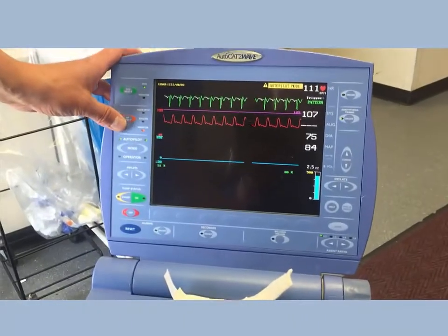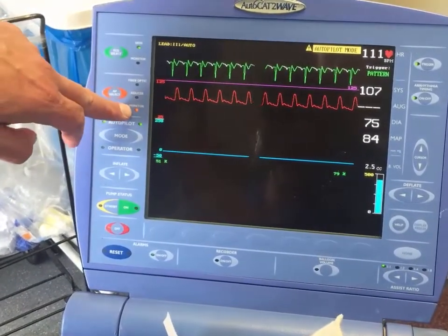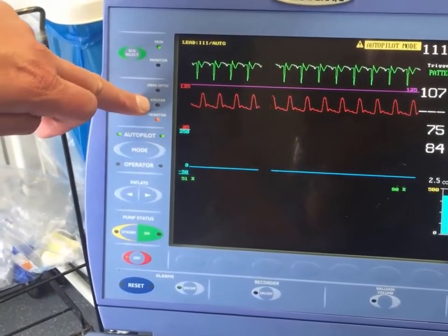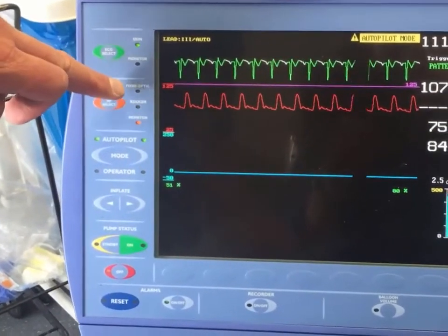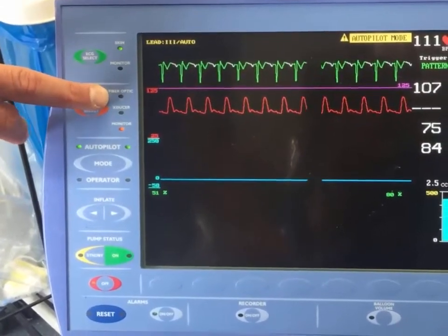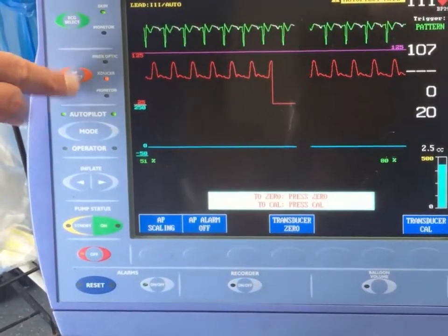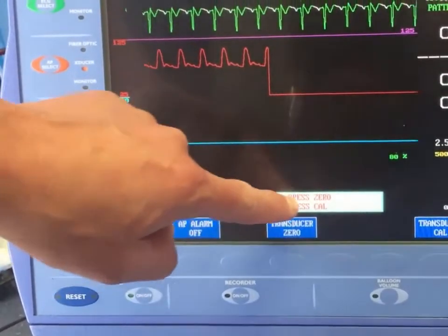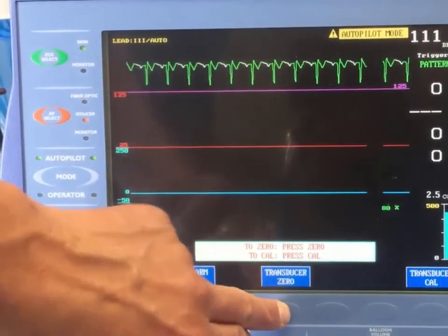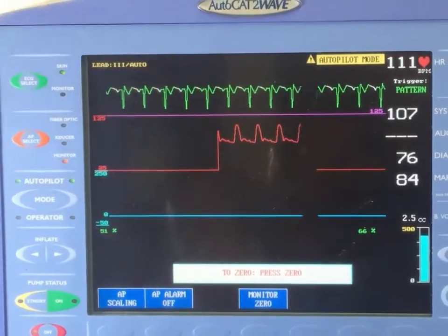We are going to zero the arterial line. There are three arterial pressure select indicators: the monitor, which can be slaved to the bedside monitor but is rarely used; the transducer, which we use about nine times out of ten; and a fiber optic option, which we rarely use because our pumps don't have that capability. Select the transducer, and it will prompt you to zero. Go off to the patient — on air you will get a flat line. Then go to transducer zero, it will confirm zeroed, and go back on to the patient.